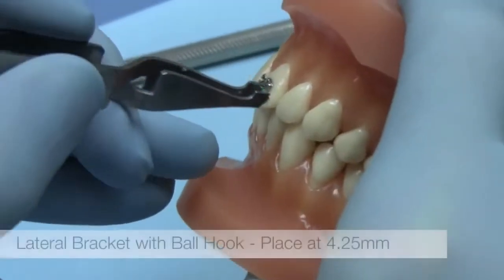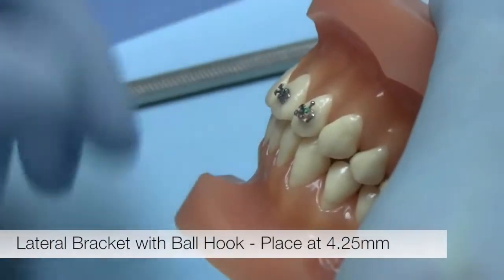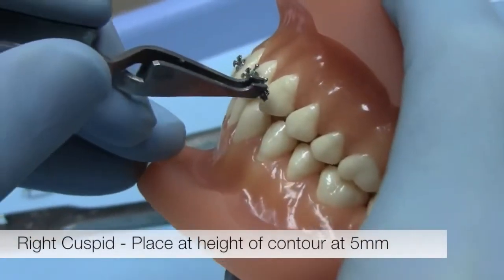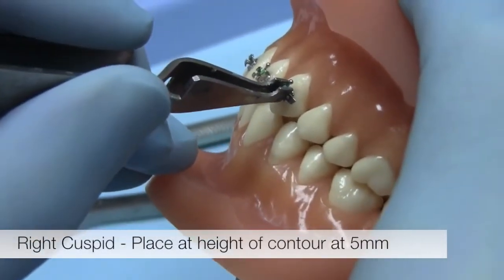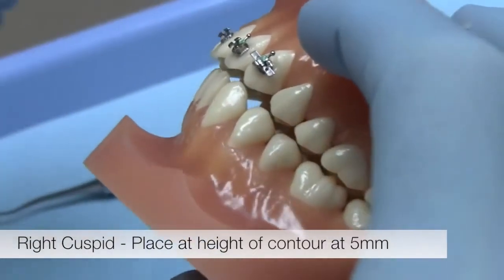The next bracket to place is the lateral bracket, which has a ball hook. It is placed just like the central, except that it has a height of 4.25 millimeters. Next, we place the right cuspid bracket, which is a single bracket with wings. This is also the first bracket placed on a tooth with a round surface.